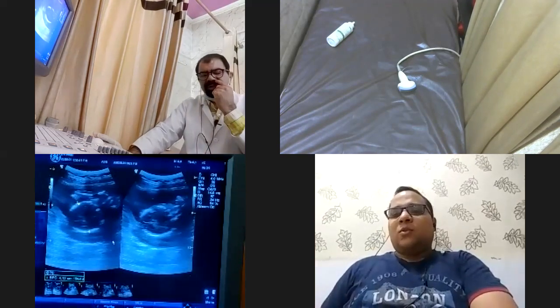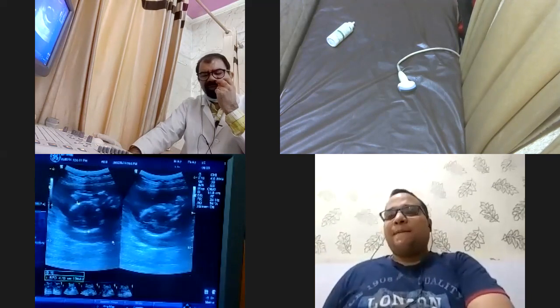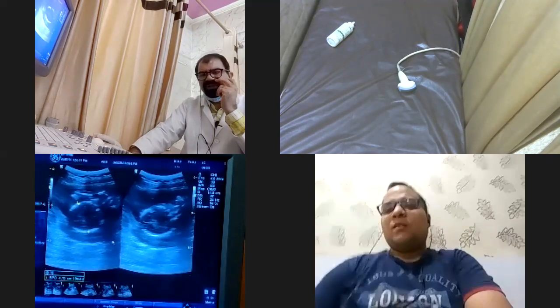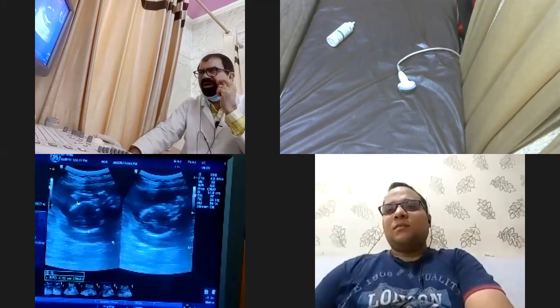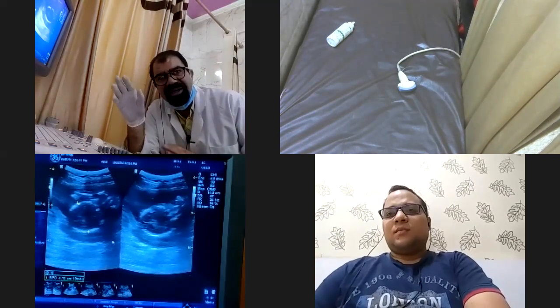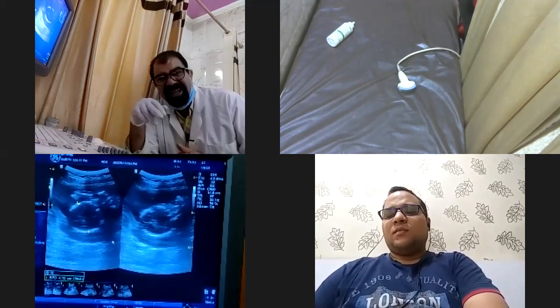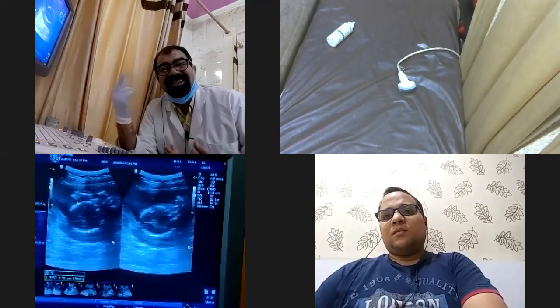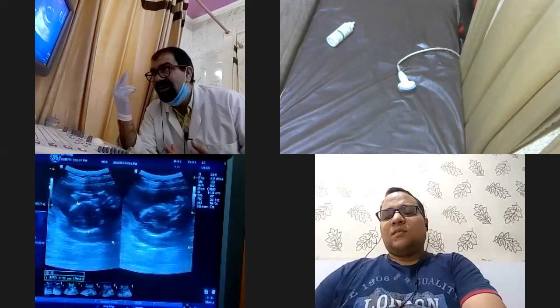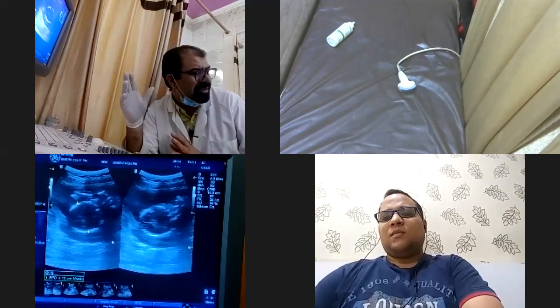I got your point. So, I got your coronal section point. Let me elaborate your question, and you will tell me whether I have got your question rightly or not. What you are saying me, what you are thinking, is that this posterior is with respect to body surface or the area, whatever I am scanning. Have I got your question rightly?